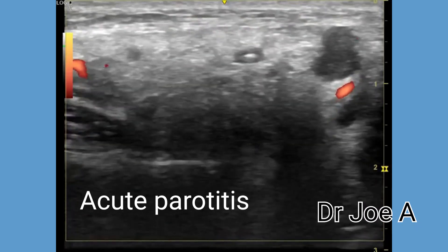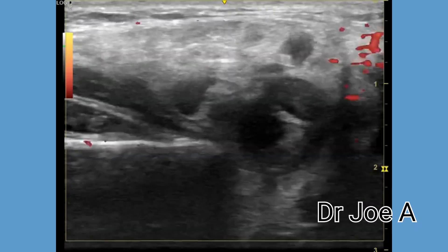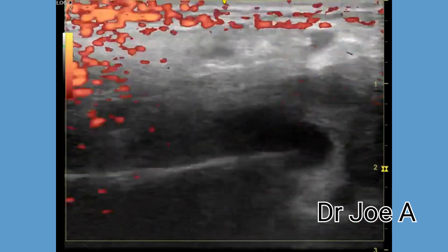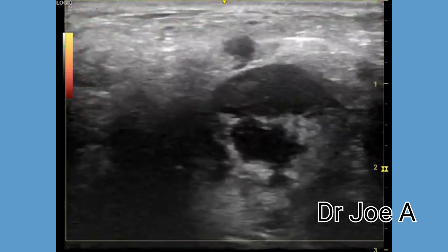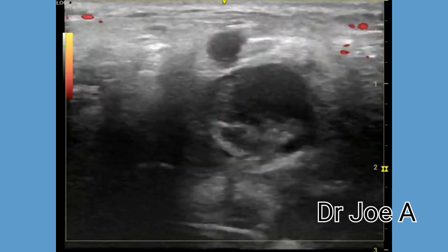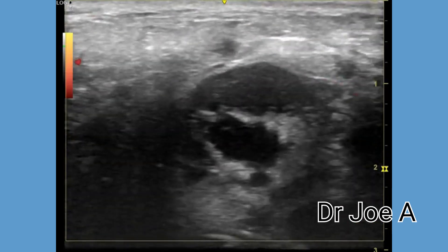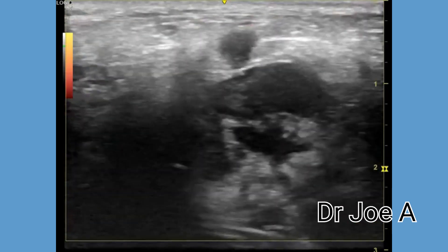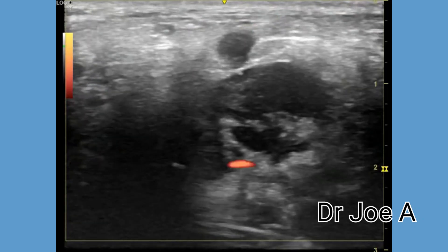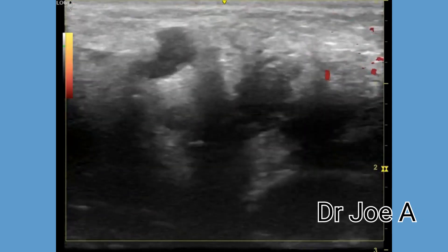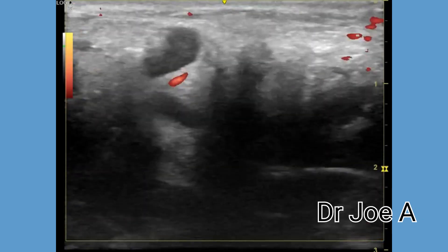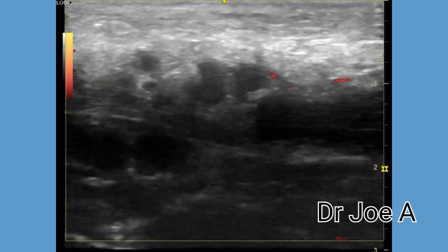Ultrasound shows multiple hypoechoic lesions of the left parotid gland with mildly increased vascularity. The left parotid gland is also swollen in size and appears mildly hypoechoic.